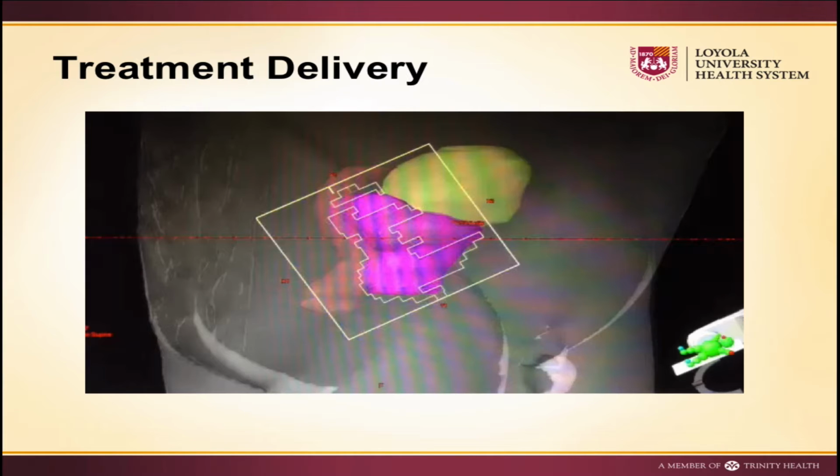You wouldn't be able to treat pelvic lymph nodes if you're limited by your field size there, but that would be the only scenario. All of our machines that we currently have, there's no restrictions. It's essentially a 40 by 40 field. So the only time we run into that is if we have to treat the whole femur in a single field, something like that. Yes, sir?